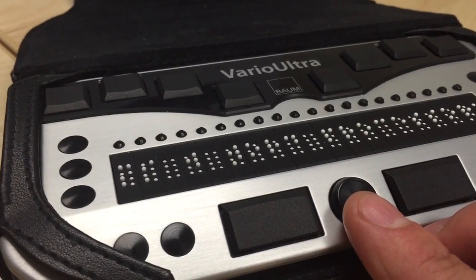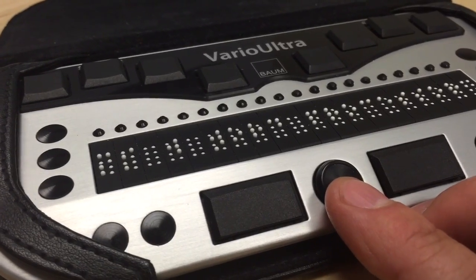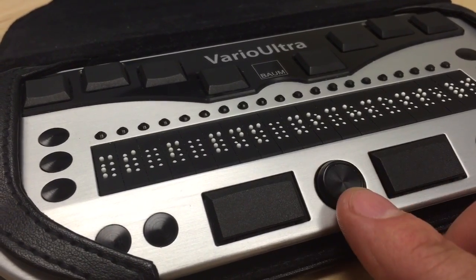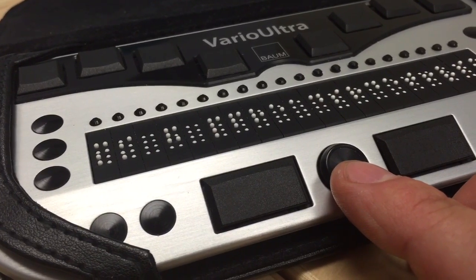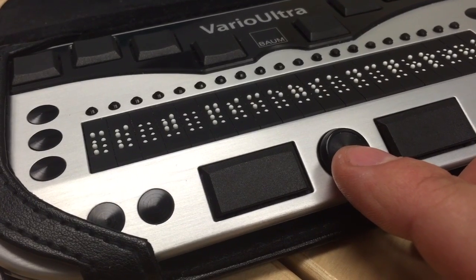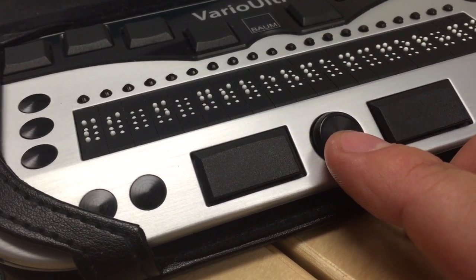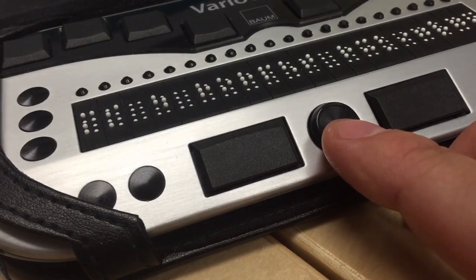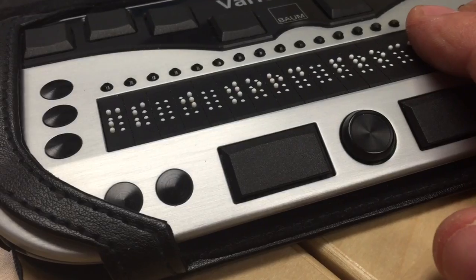Right now we're actually in the word processor menu. As I use my NaviStick — just like a joystick feature — to come down, we move to the PDF viewer, the spreadsheet viewer. We then get to the file management. We have the calculator and the timers, alarms and clocks, and so on until we come all the way back around to the word processor.